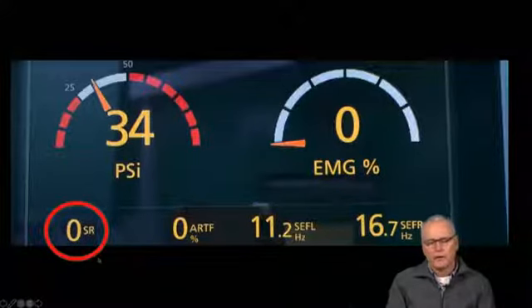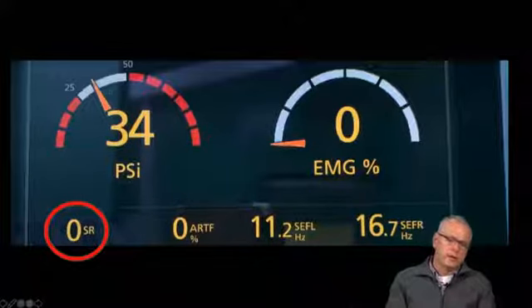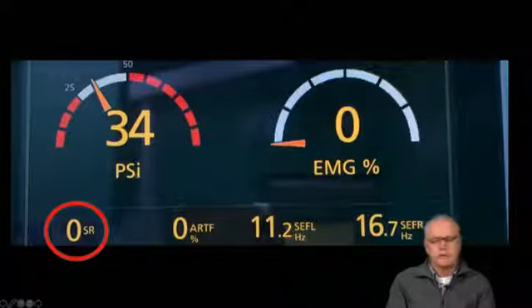More on this later. I'm just going to take a little digression here and talk about this index here, the PSI, in this case for this monitor. Most processed EEG monitors provide an index.